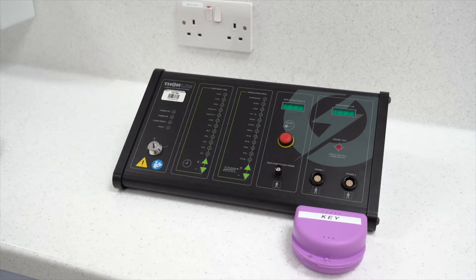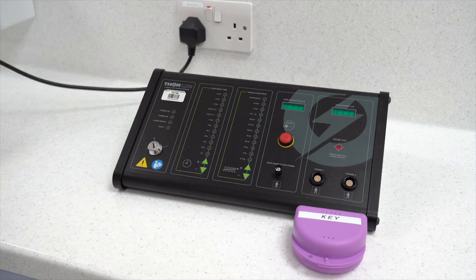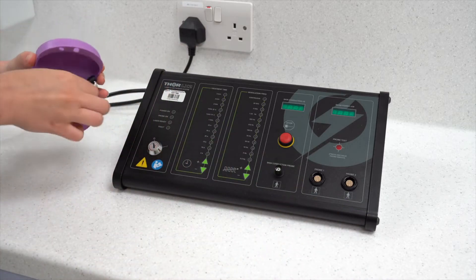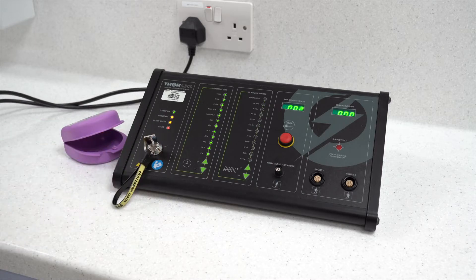Prior to use, the equipment should be cleaned as per the instructions in the standard operating procedure. With clean ungloved hands, plug the control unit into the mains electric supply. Insert the key, which will be kept in a box with the control unit, and switch the control unit on.